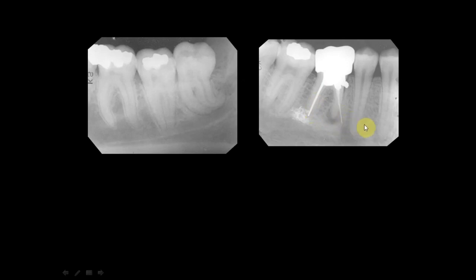So I hope you've understood what the radiographic anatomical landmarks are all about, and definitely you should know how to locate each of these landmarks. Then, based on these landmarks, if you find any differences in them, you can consider the pathological condition that might be affecting these landmarks.